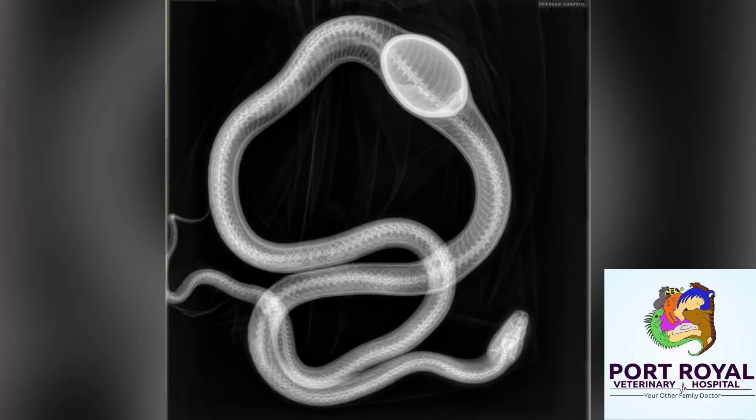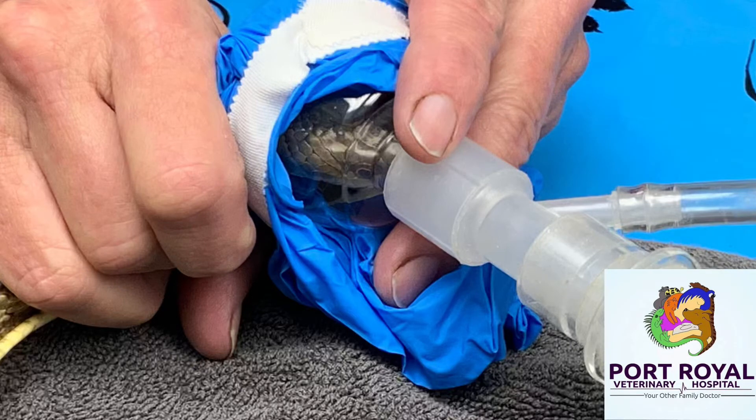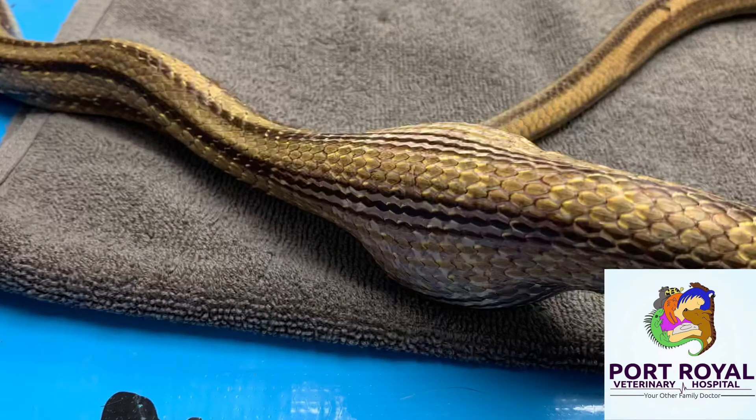This is an x-ray of a garter snake. This garter snake was found in someone's chicken coop. They had placed a ceramic fake egg and found it missing and a large bulge in the snake. They called the local vet who referred them to us.